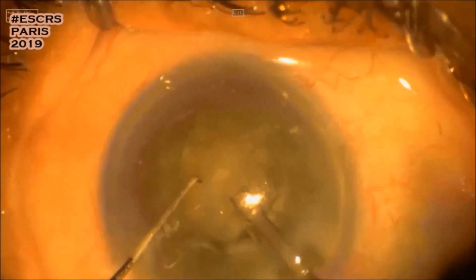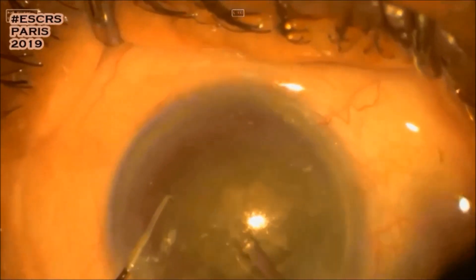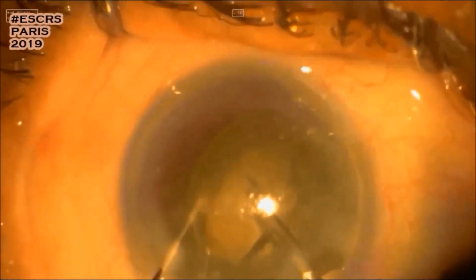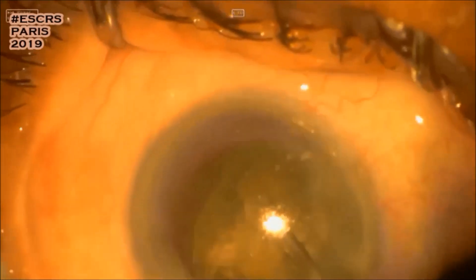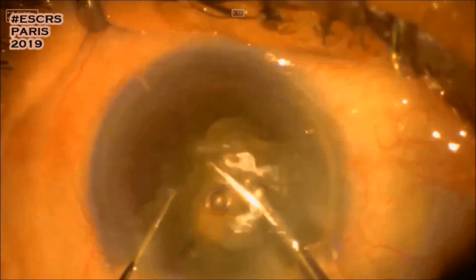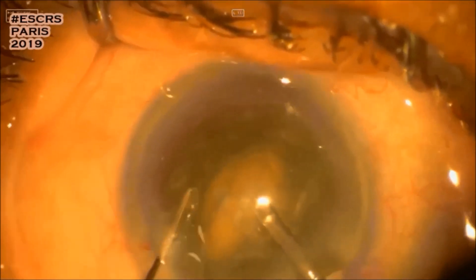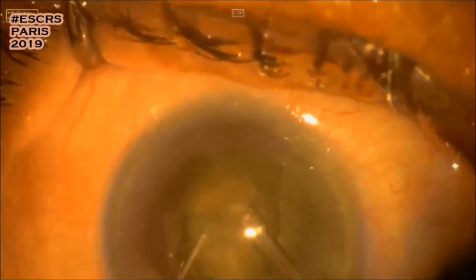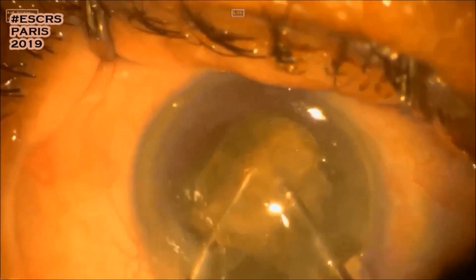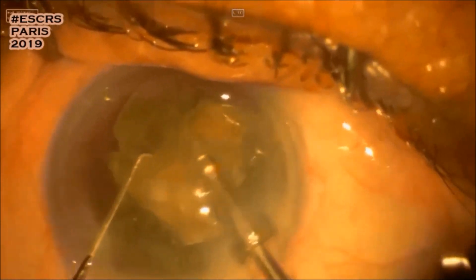Now we go to high vacuum and high flow to bring the piece up. Another chop — I try to stay very centrally with the phaco tip.